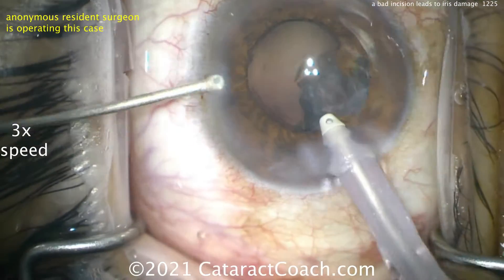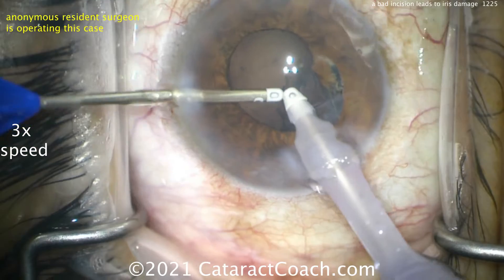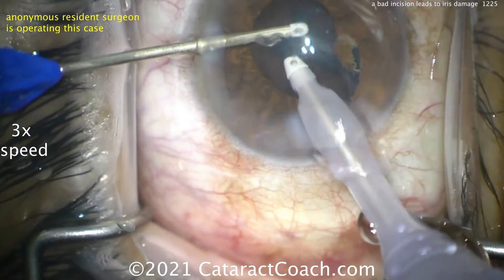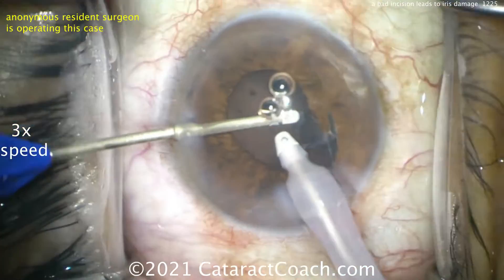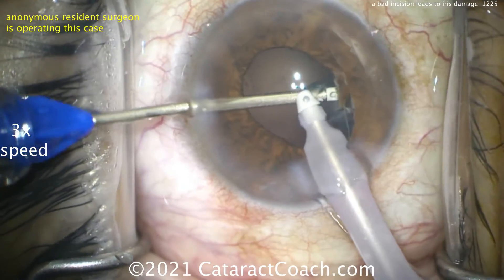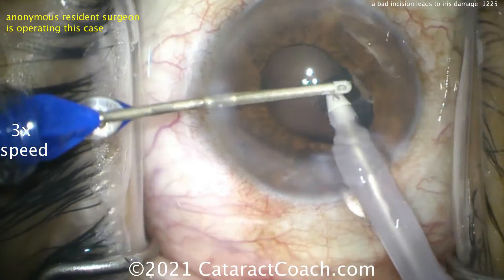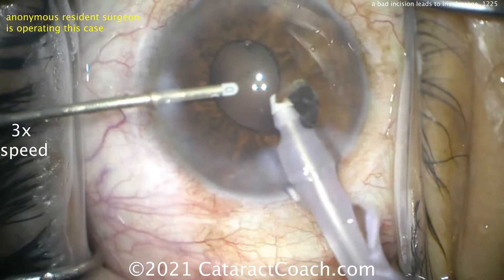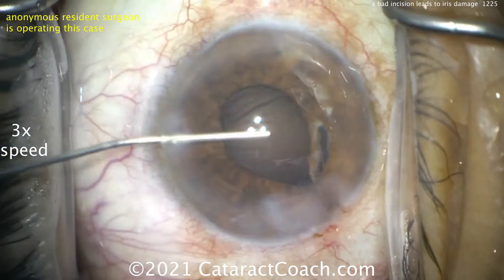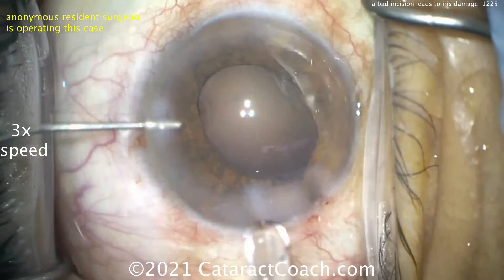We've got to take out the rest of the cortex. I like the split here to the bimanual approach — the bimanual approach is great because it allows us to get underneath that smaller pupil and avoid grabbing that iris. Don't touch the iris — keep that aspiration port deeper in the eye. You see that iris just wants to prolapse more and more.